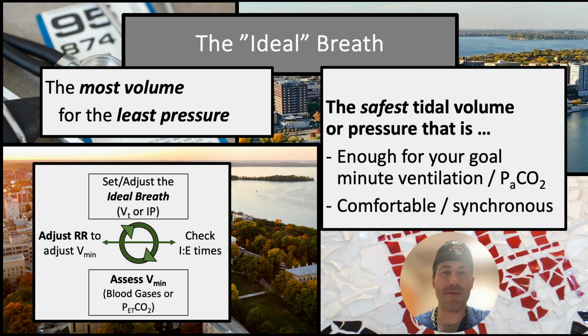Now, we keep revisiting this ideal breath, and it's the top part of our ventilator adjustment curve. And from this, we always are going to work through the rest of the situation here and revisit the ideal breath. So let's walk through that a little bit more.